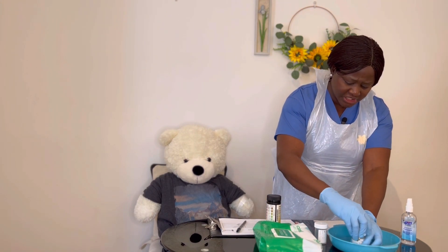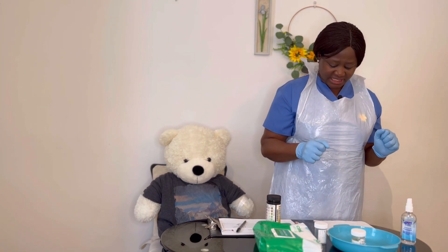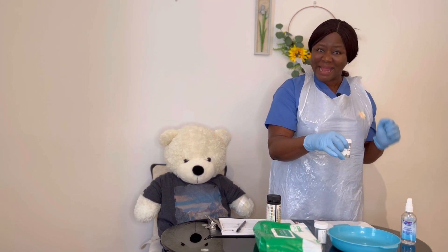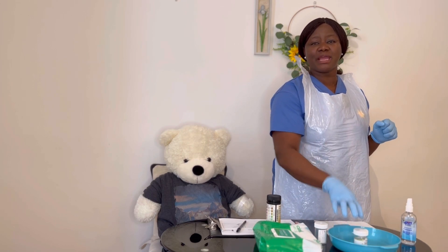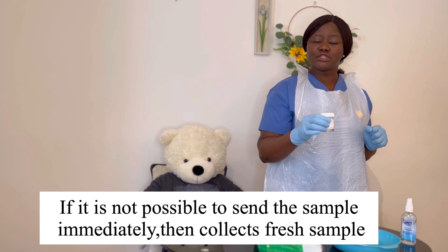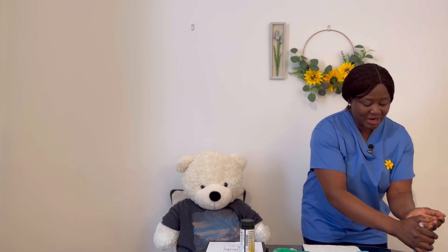Assessor, I will make sure all items are cleaned and made ready for the next use. I'll leave the reagent strip as instructed. The urine sample — I'm going to send it to the lab if there is need. If there is no need or indication, I will discard it into the clinical waste, pour the urine into the sluice, and discard the specimen container in the clinical waste. I will make sure a fresh urine sample is collected for sending to the lab and that the necessary details are filled on the lab form. I ensure everything I used is discarded. I remove my glove into the clinical waste and my apron into the clinical waste. I do my hand hygiene.